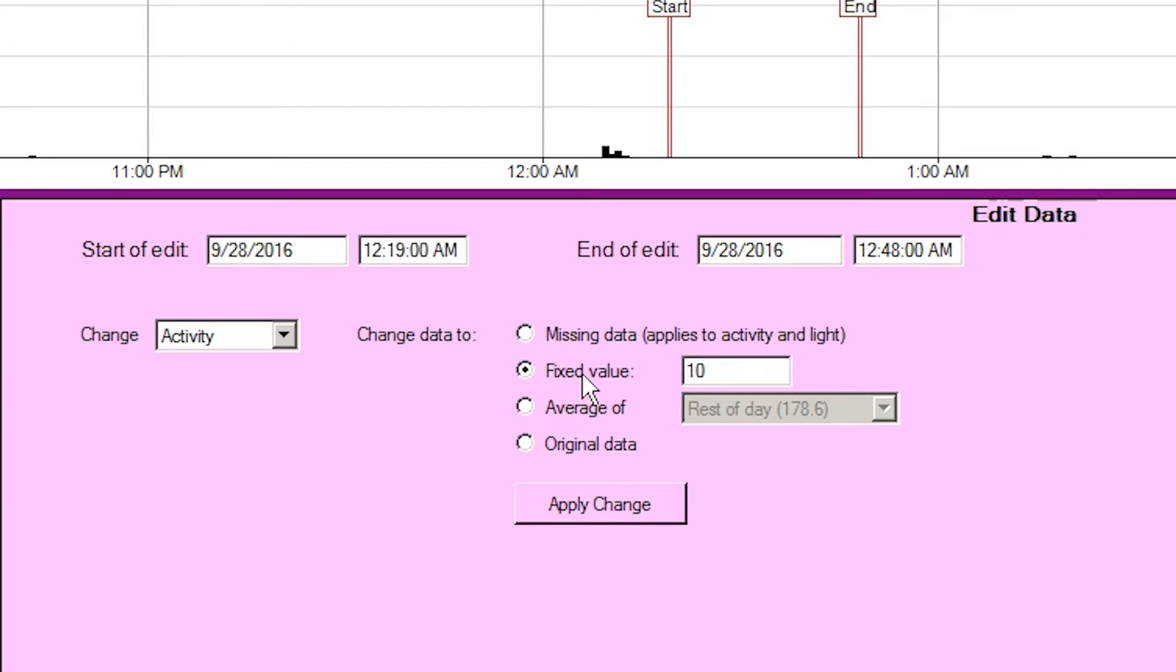Fixed value, this will set the data samples either activity or light to the value entered in the box.